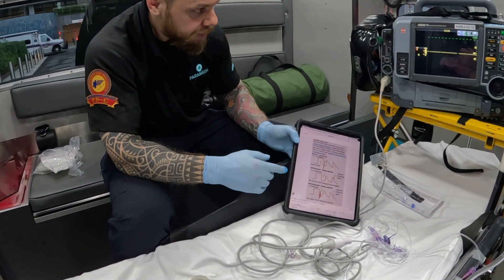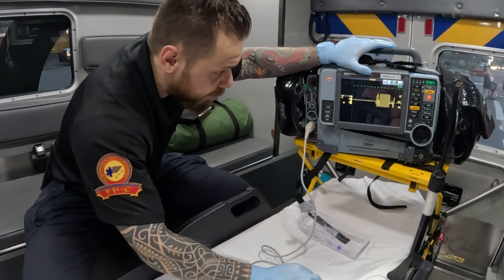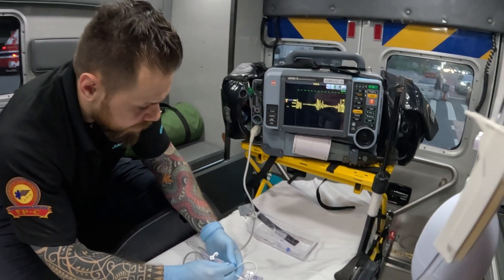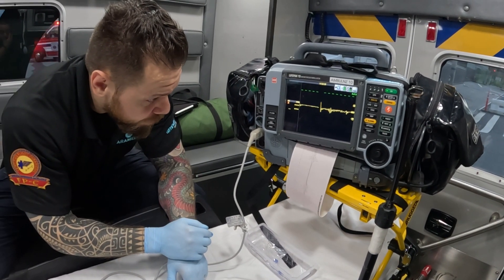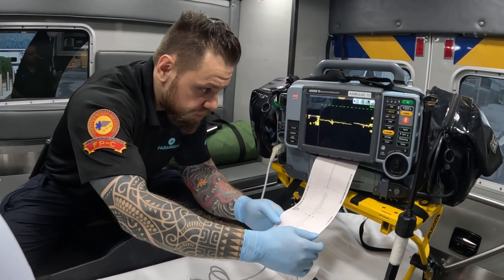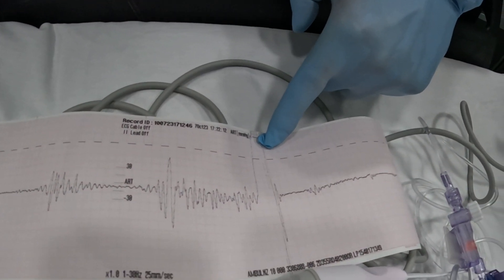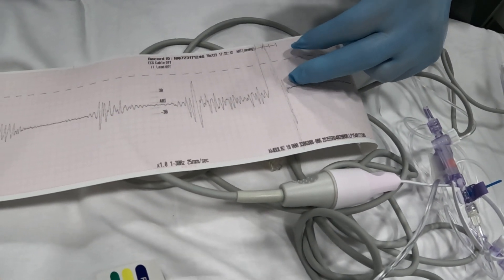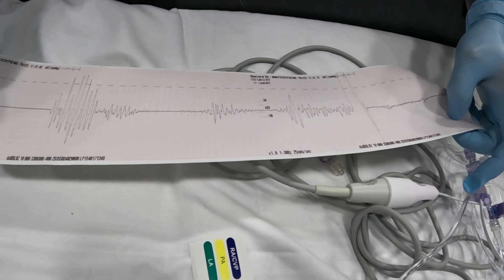I'll add an additional video showing this on a patient with an arterial line so you can see what a square waveform test looks like. Ideally, you want to print it. What I usually do is while transducing a pressure, I click print, and as the print is coming out, I come over and do a square test. You can see how it looks — when I perform the square test, pulling on this tab flushed the system, and a normal square test shows 1.5 to 2 oscillations, then returns to arterial waveform.